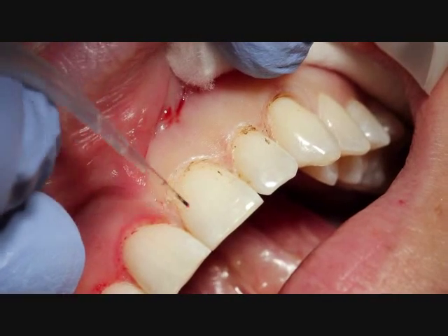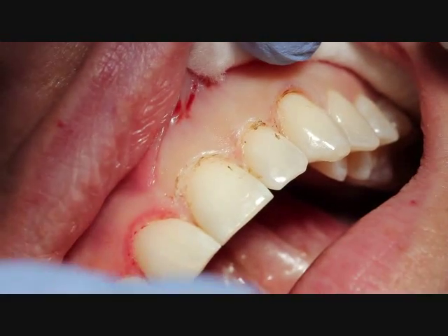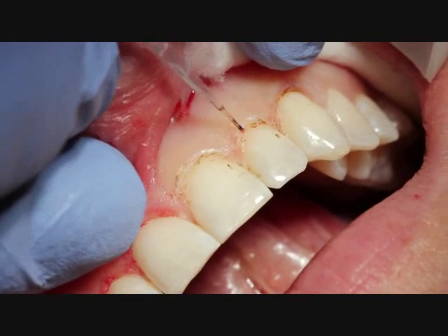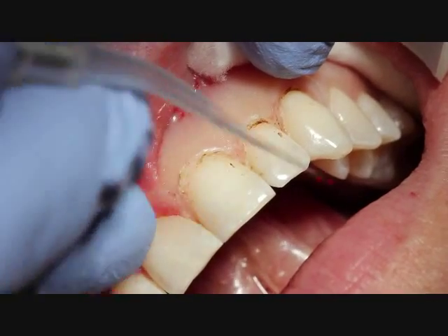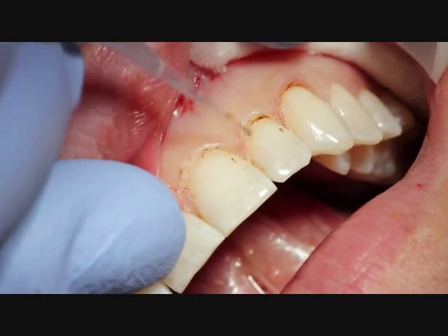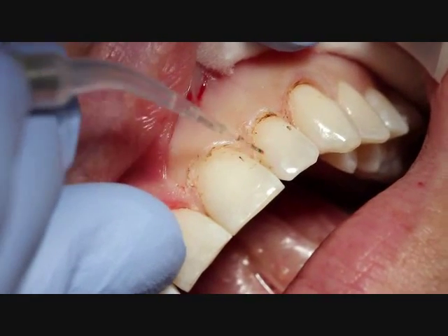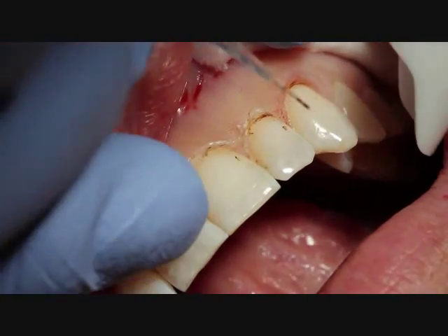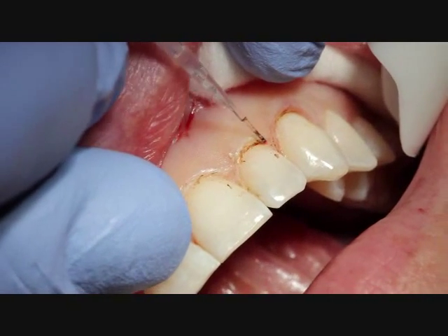Sort of a sweeping motion, just going along gently removing that tissue. You have to remember that you are going to be limited to how much tissue you can take away, because if we do take too much tissue away, we will start impinging on the attachment. And then we'll get either a growback of the tissue or a chronic inflammatory response, or that reddish ring that sometimes we see when we place a crown or a restoration that is impinged on the biologic attachment.